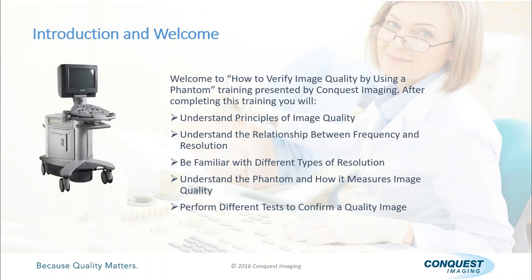So we talked a little bit about what we're doing. It's understanding the principles of image quality, frequency and resolution, how they work together, and different types of resolution. We're going to talk about all this today. I only have one phantom. Please pass it around as we're talking, or come up afterwards and we can see it in hand. It's hard to see from way back there, I know. But we'll talk about it and how to use it, and the different tests. There's going to be 2 presentations basically today. The other one I'll open up at the end.